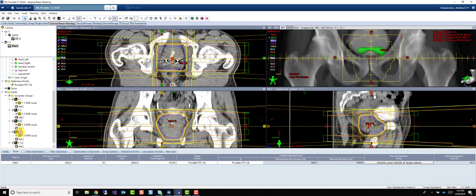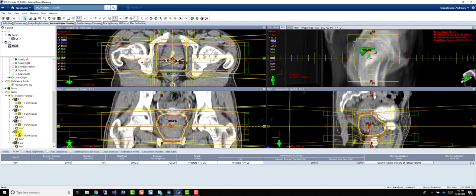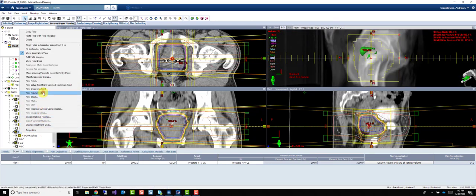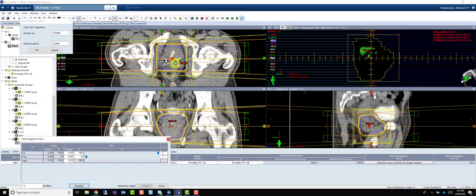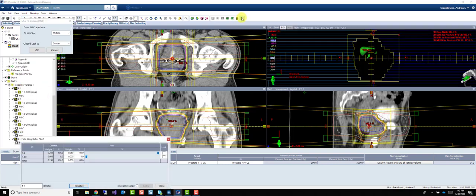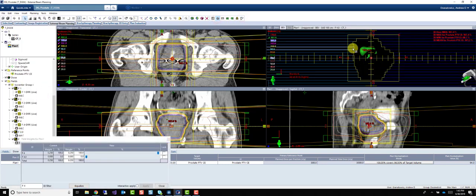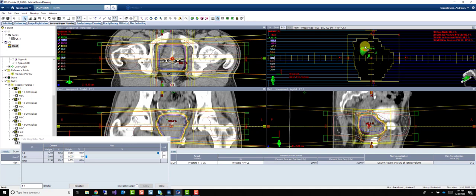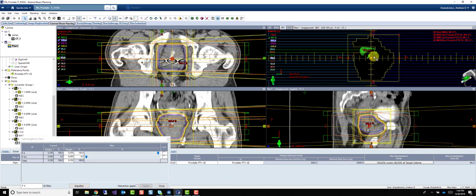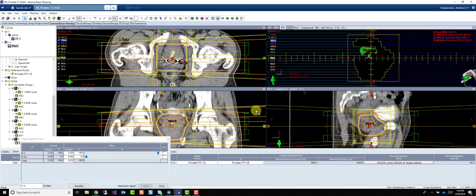We can move on to the other side, which is F4. Sometimes when the cloud I'm trying to block gets so small, I'll just manually manipulate these. Let's try that.